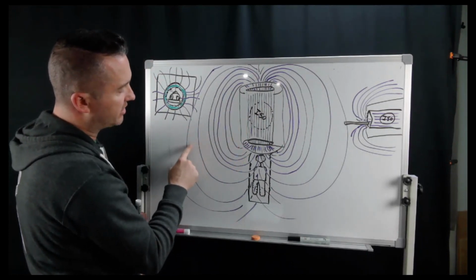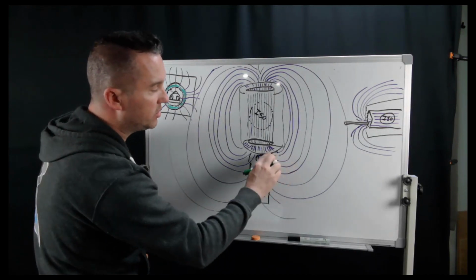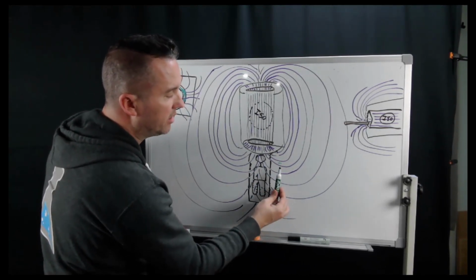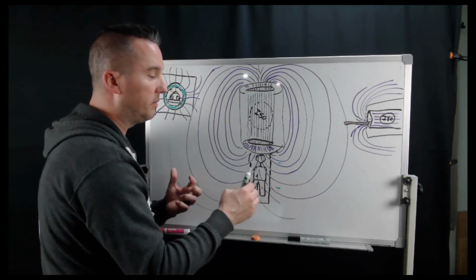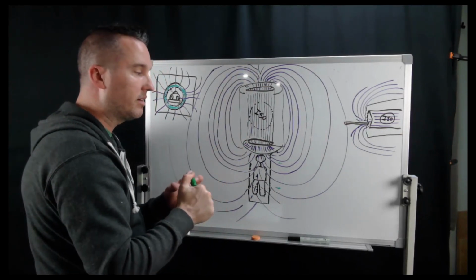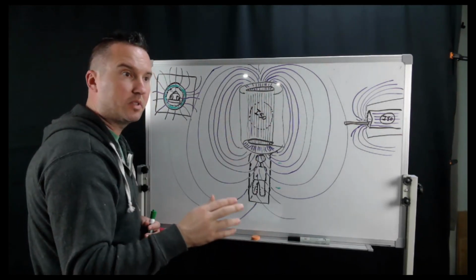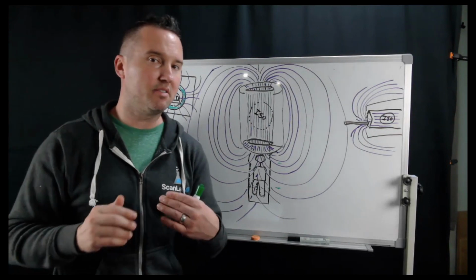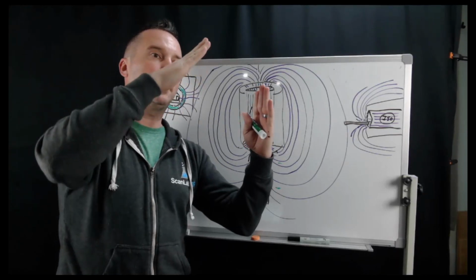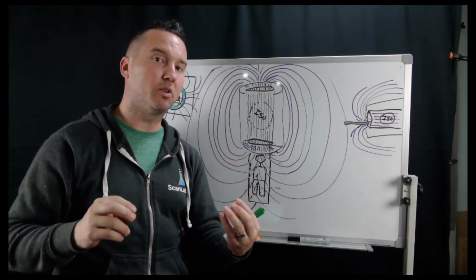Out here, there's not a lot of flux density, so there would not be a lot of pull on my object. Whereas here, as soon as the flux density is changing, if I were taking something through here, there's a larger change across space, and that slope is how quickly the magnetic field is ramping up. We have maximum like 3 Tesla here, and at the place that the tech is actually sitting, there is 0 Tesla, like the Earth's magnetic field. So in between, there are certain places that have a very abrupt slope. Those are the areas of high spatial gradient values.